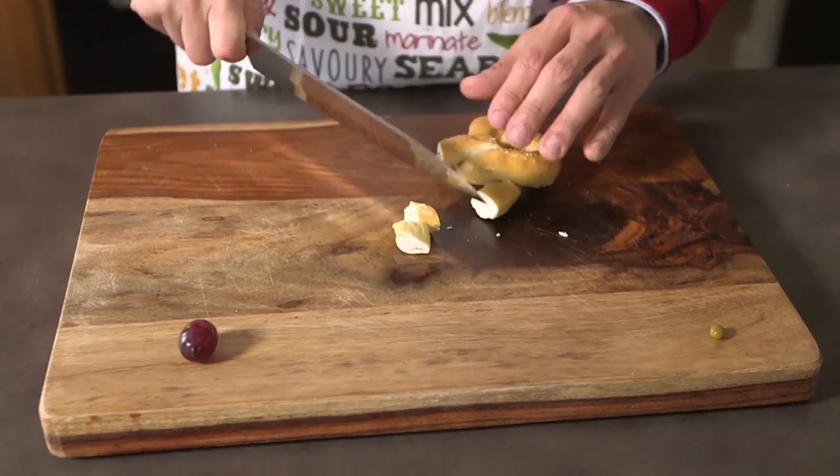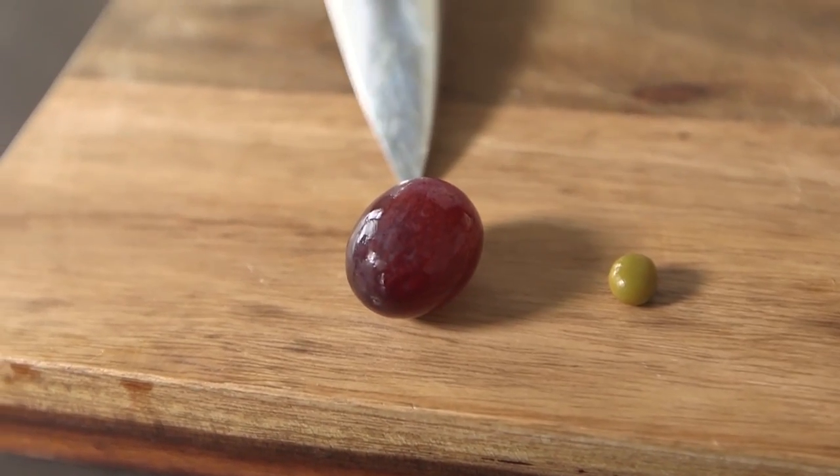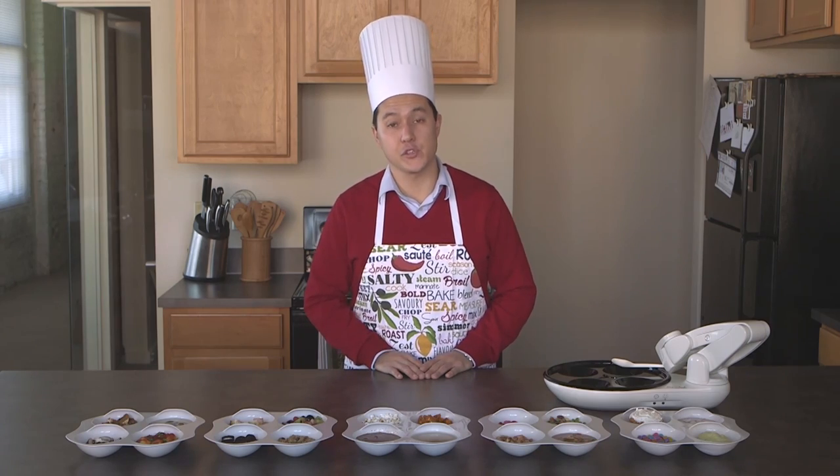When prepping food, OB feels comfortable with anything prepared within a certain size range — from about a pea to a grape. Here are some examples of food we've prepared to show you just how much you can let your imagination run.